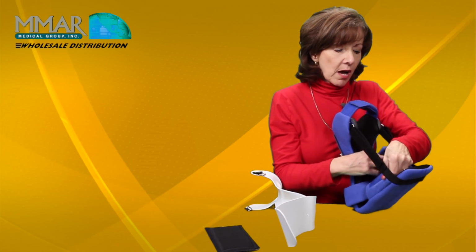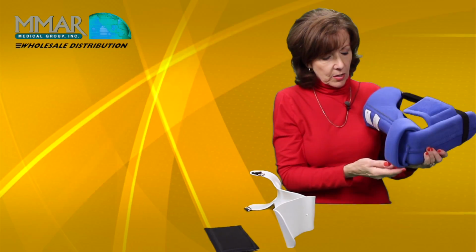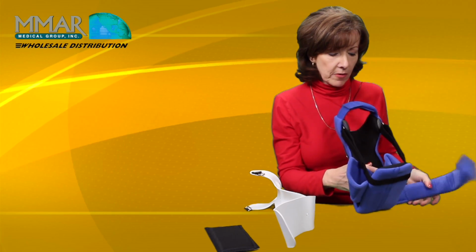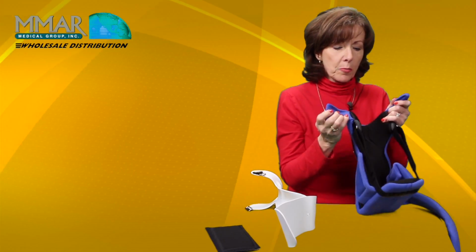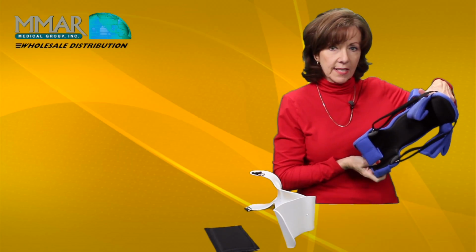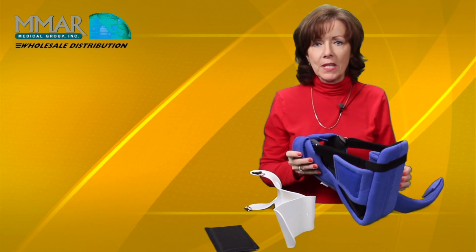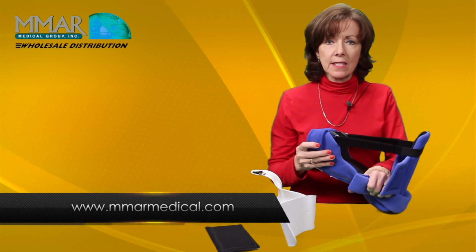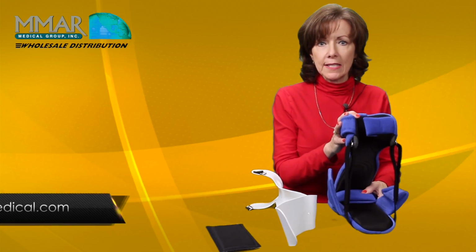To take the boot off, you simply open this, tuck the Velcro back. You're going to open the talus strap, tuck the Velcro back, it's out of the way. Open this, again, tuck the Velcro back, and you simply take it off your patient's foot. When it's time to put it back on, you lay it under their foot and you begin again. It's very simple and easy, and this is the Neuroflex Restorative FootEase boot.